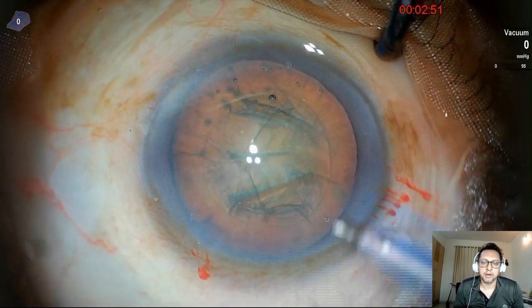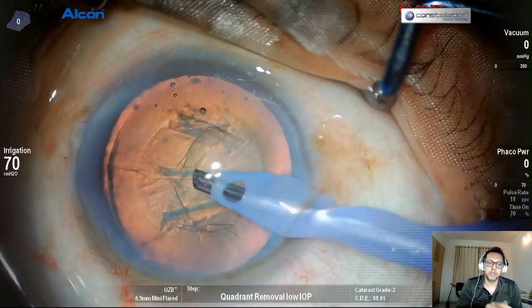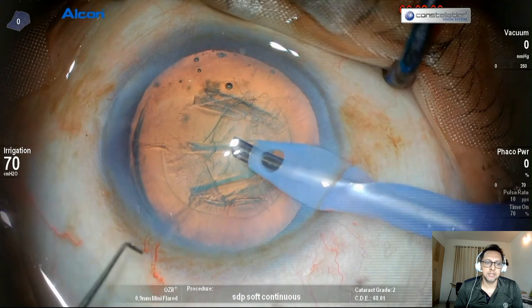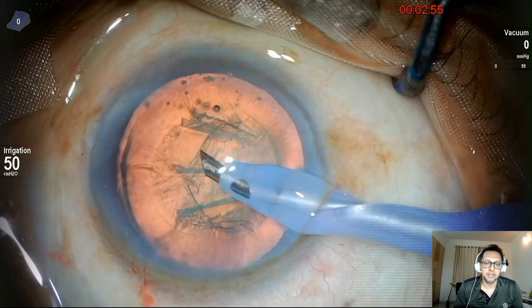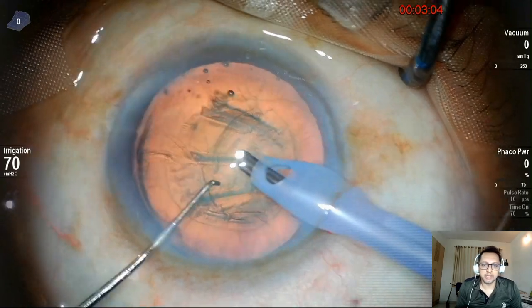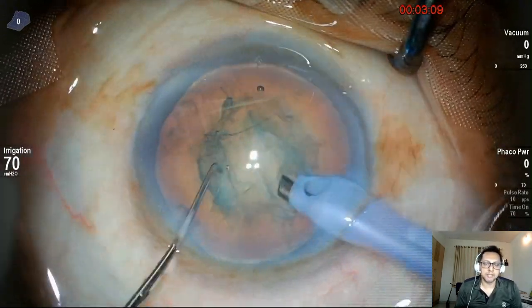There goes my FACO probe and I am going to do primary chop. I always go in with a lower bottle height. Just as I begin, you can see the bottle height on the left side — it's 50 centimeters to begin with. So when I enter, I enter at 50 centimeters so the patient gets used to that. Then I raise it to 70 centimeters, which is around 50 millimeters of mercury pressure, and the patient is quite comfortable with that.